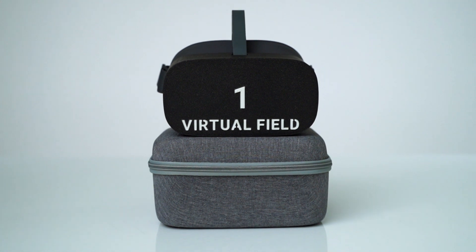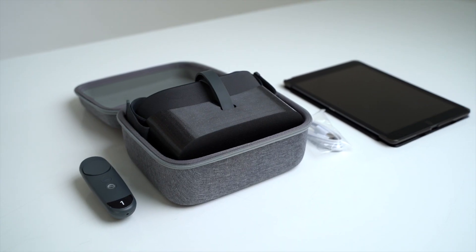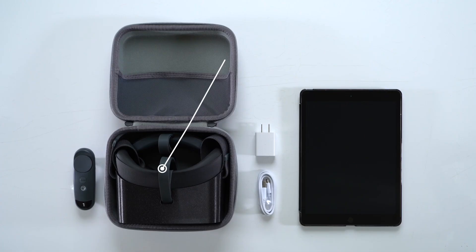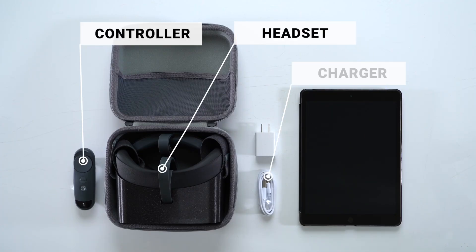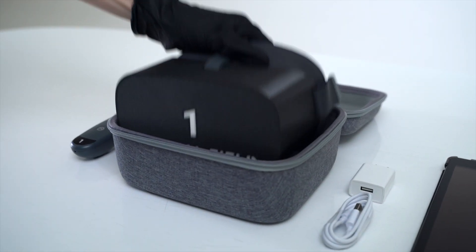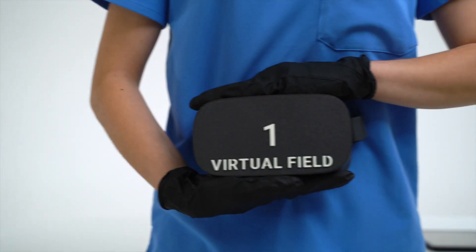Virtual Field is the perimeter that your patients and staff will love. Every instrument comes in a handheld carrying case. Inside the case is a headset, controller, charger, and 50 disposable hygiene covers to keep your device clean in between uses. It's small, light, and completely wireless, so you can start testing in any room of your office.